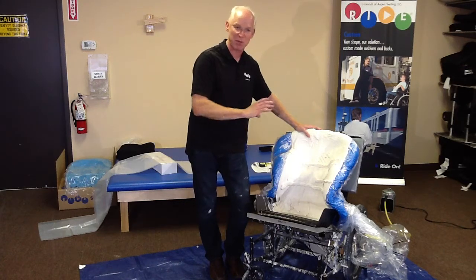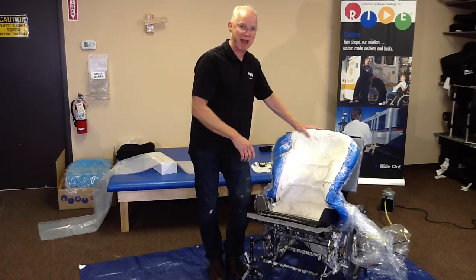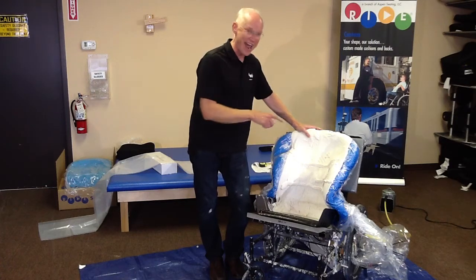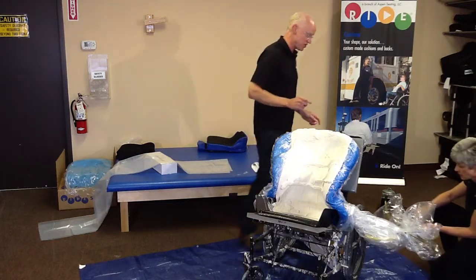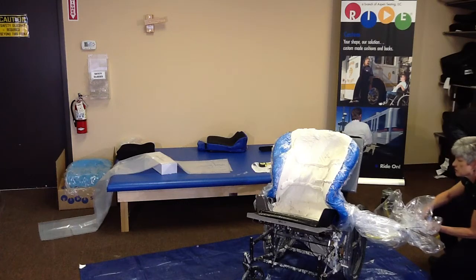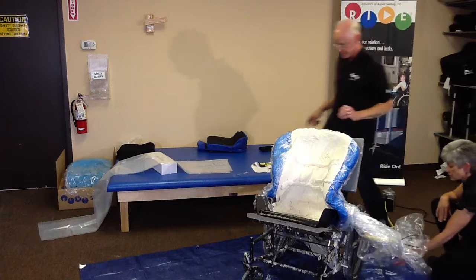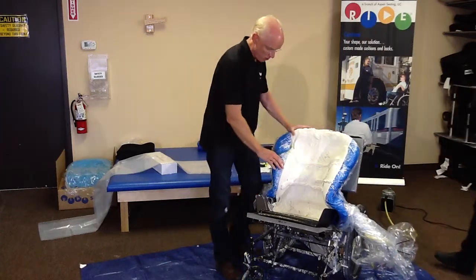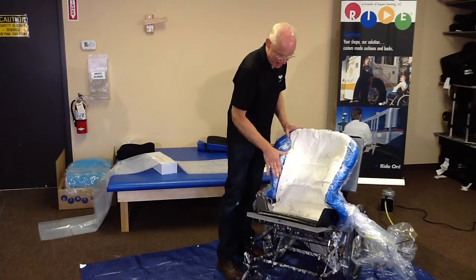So the order form is complete. All the information's on there. And it's now time to let some air back in the bag and remove the cast from the bag. So what we'll do is go ahead and put that to soft. Slide the valve to soft. Turn off the pump. With the pump turned off and the bag valve to soft, that'll let some air back into the bag.